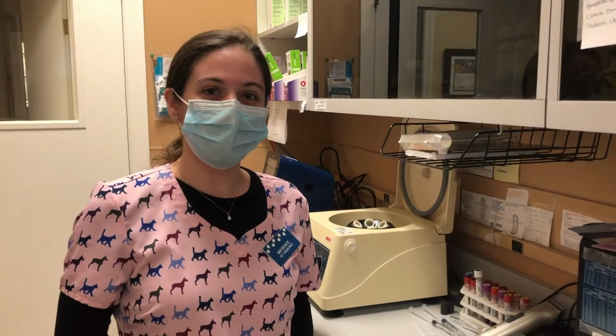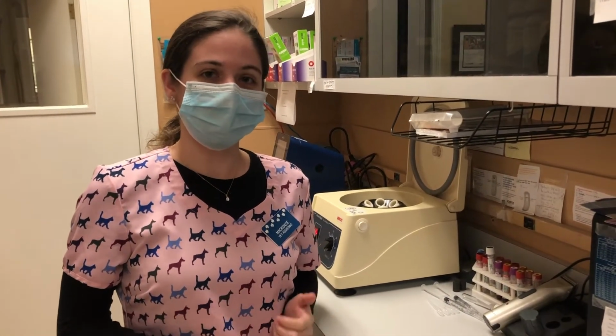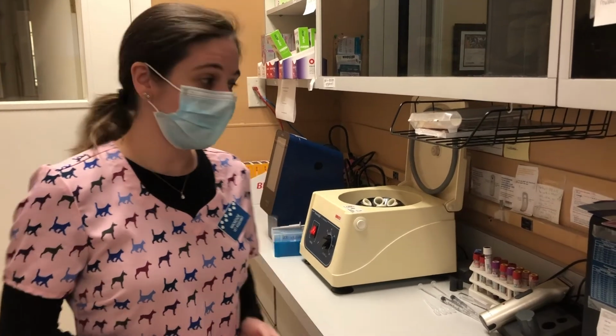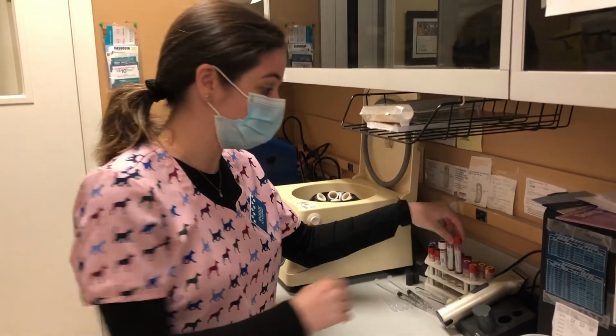In this video, I'm going to be demonstrating how to perform a cross-matching agglutination test. This is to test the blood of either two dogs or two cats to see if their blood type is compatible enough for a blood transfusion. So first, you'll need blood samples from a donor animal and from a recipient.